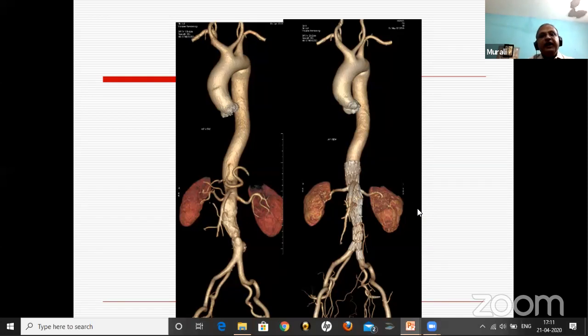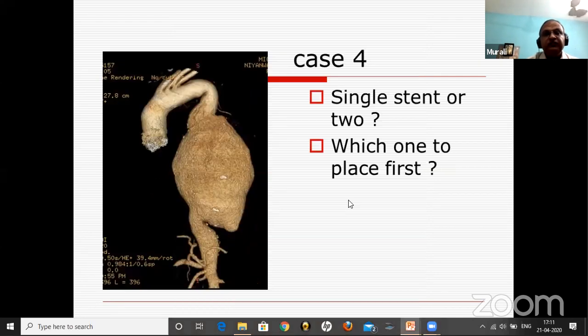And the most ideal thing for a patient whose neck is inadequate is to go for a fenestrated procedure. You can either do an on-table fenestration. The preferable thing is to do a 1 or 2 vessel fenestration. If it is more than 2 or 3, it is better to order a fenestrated stent graft. But if your experience is good, then you can go for multivessel fenestration. This is one such patient where we have done a multivessel fenestration to improve the landing zone, because there was hardly any landing zone. So we had to put in catheters with stents into the superior mesenteric and the renals.